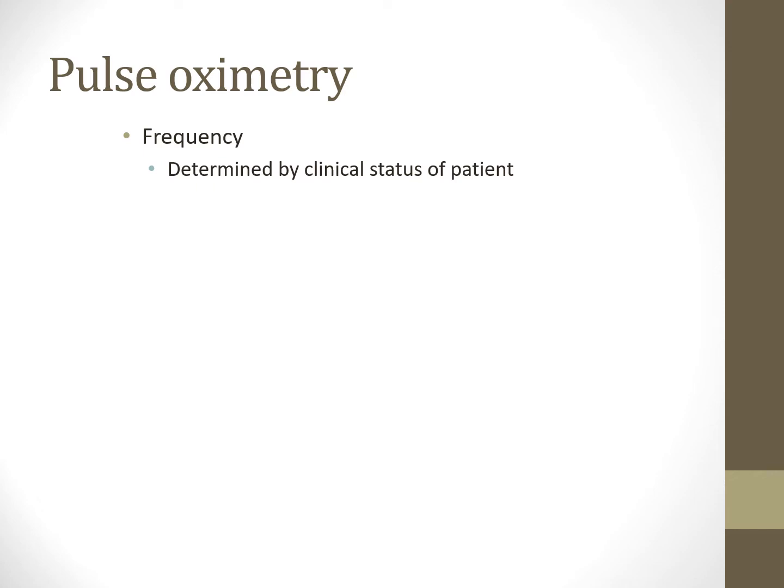Pulse oximetry. Frequency of pulse oximetry is determined by the clinical status of the patient. It could be just with vital signs, right? Remember, pulse ox is technically, I think, your 6th vital sign. So it's not sort of required. Some hospitals do require it, so that's more of a facility type thing.